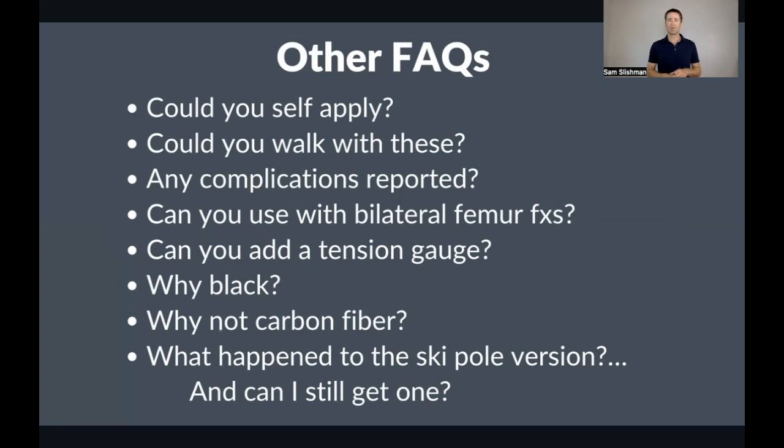Any complications reported? I can think of one. The thumb screw in the original STS, somebody cranked it very tight and it protruded slightly. Somehow that protruded bit of screw got pushed into the skin of a patient in Australia. It was not a deep penetration, it just created a nick. Anyway, we shortened the screw. I don't think that's going to be an issue for anybody anymore.